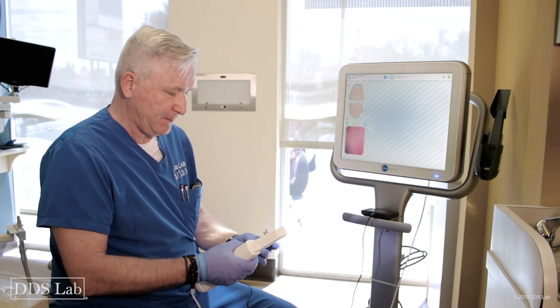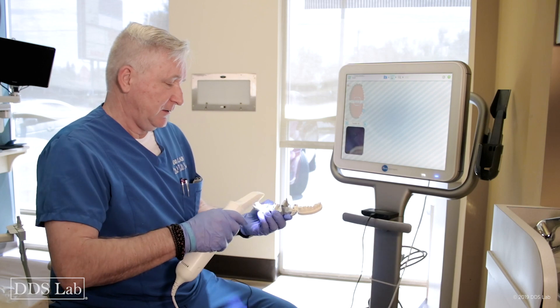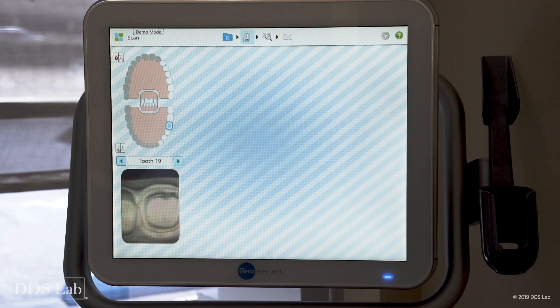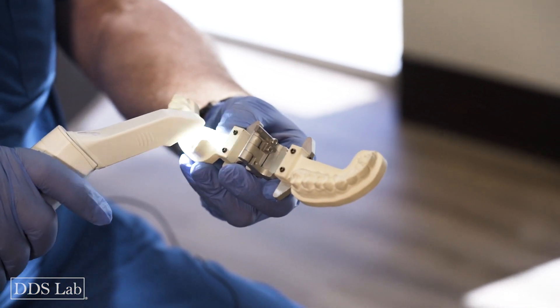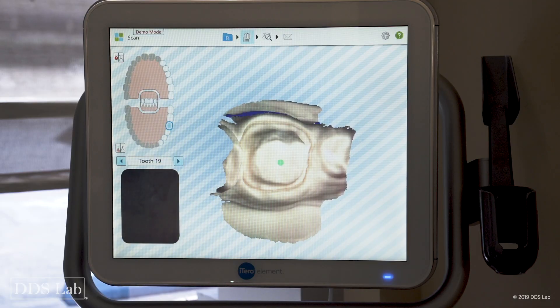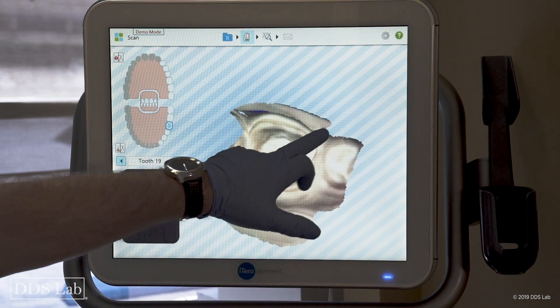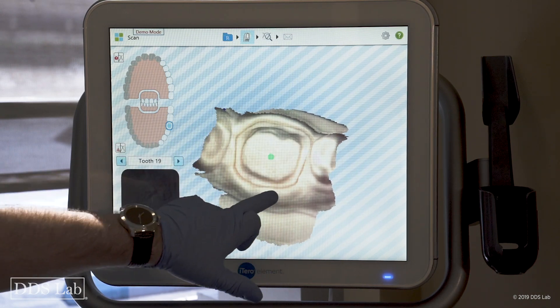Now I'm going to do the prep scan. When scanning the prep, make sure tissue management has been done perfectly — meaning the margin is clearly exposed and nothing is in the way. I scan to the lingual, do the buccal, and take care of my contacts making sure I get them nice and easy with nothing left behind. After five seconds the scan is done.